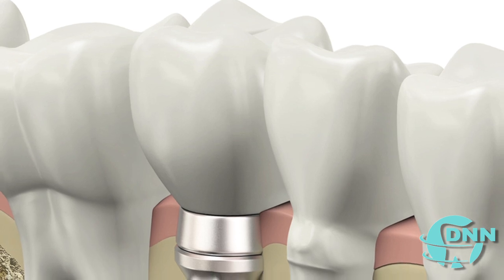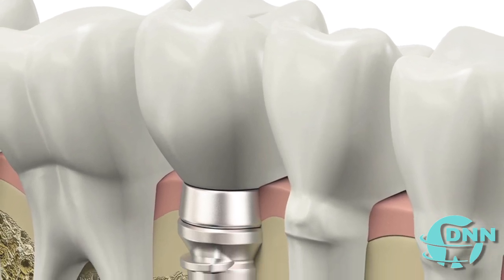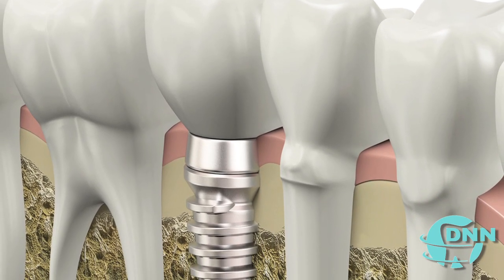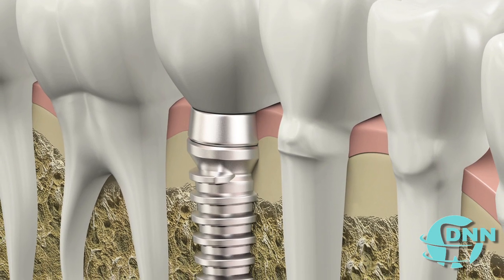And so there is a whole array available today of different types of components that can be used to maximize aesthetics. We use ceramic materials such as zirconia, which women would know as a substitute for diamonds, but it's a very hard mineral, and it can be made as a porcelain product. So when we use it, it's natural tooth colored. It can be shaped exactly like a tooth. Porcelain restorations such as crowns can be attached to those ceramic components, and I would defy anybody, even dentists, to look in somebody's mouth and tell where the implant is.